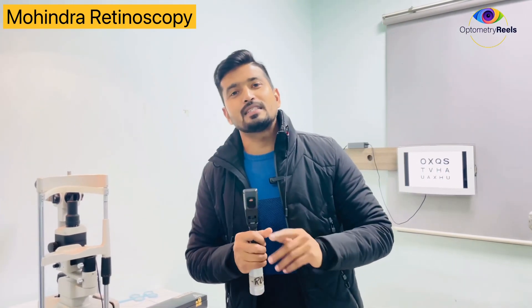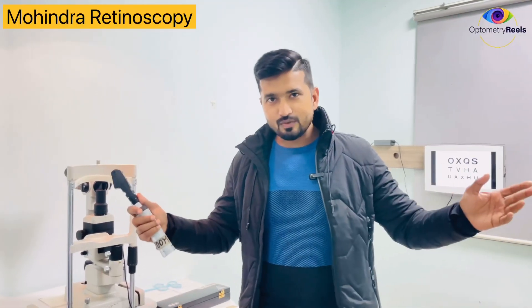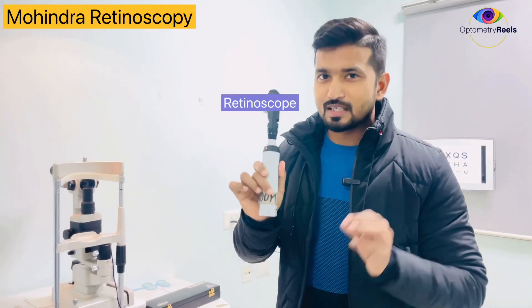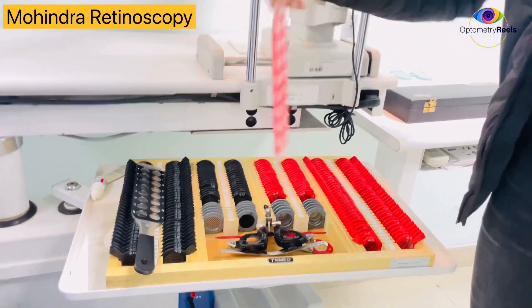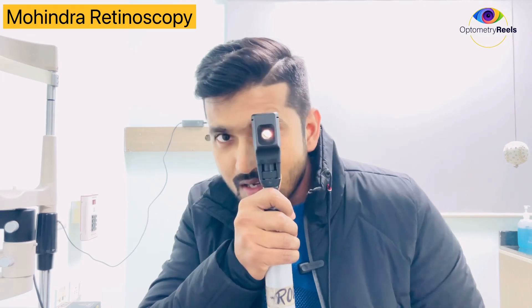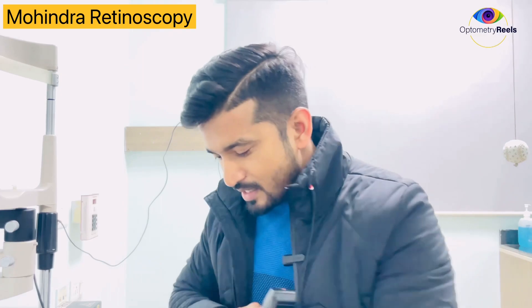It is usually performed at a distance of 50 cm, and I'll show you what the working distance compensation should be at the end of the video. The basic requirement for Mohindra retinoscopy is a retinoscope. You can use the regular trial lens set or the lens rack to neutralize the reflex. You need to maintain the working distance of 50 cm and occlude the other eye of the child, then use the lens rack to neutralize the reflex.